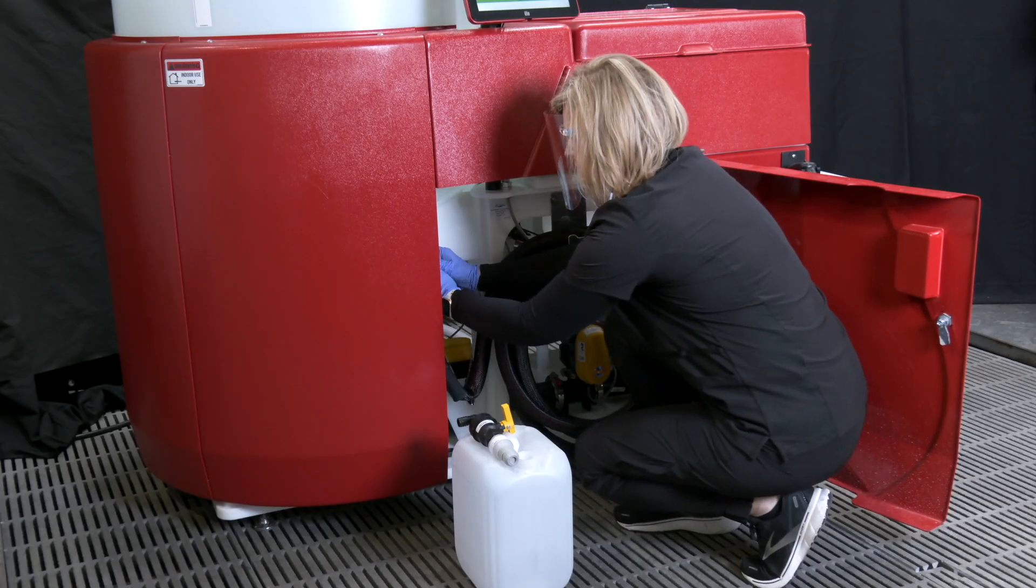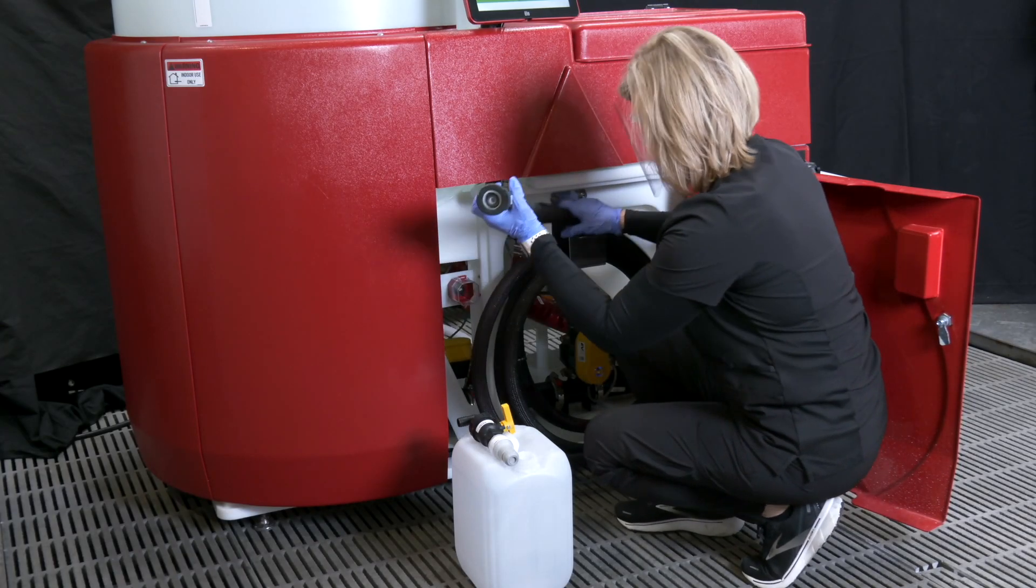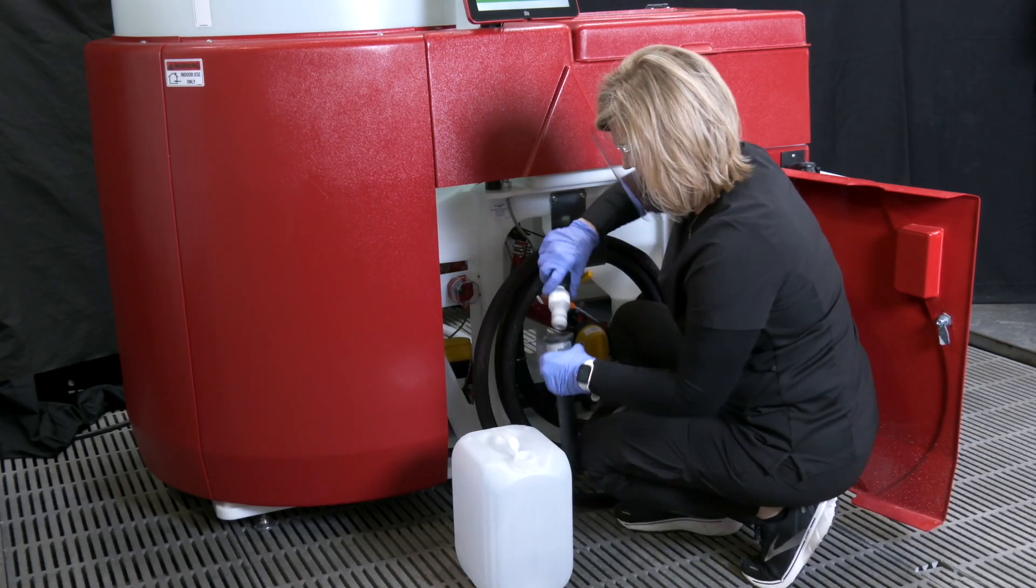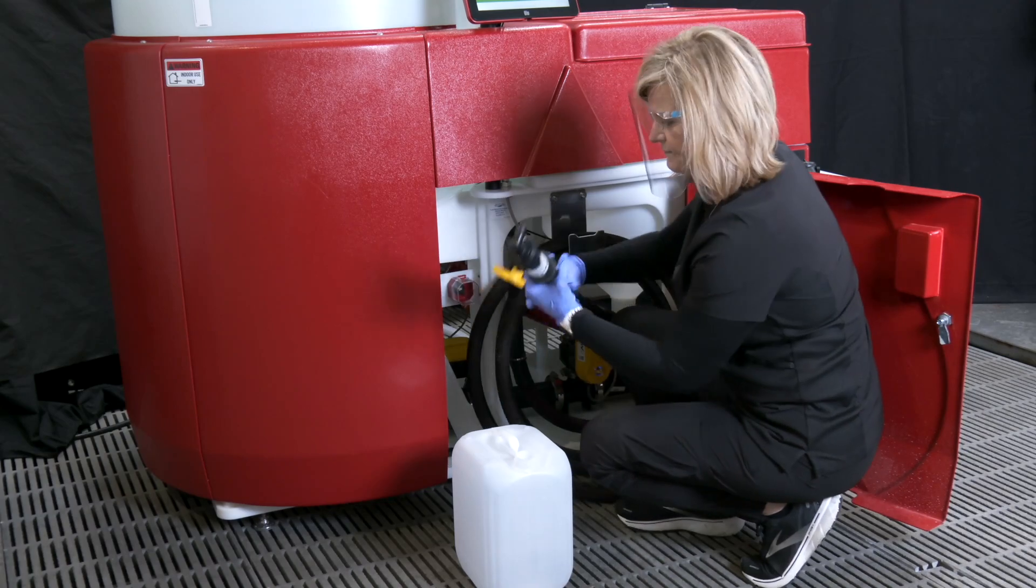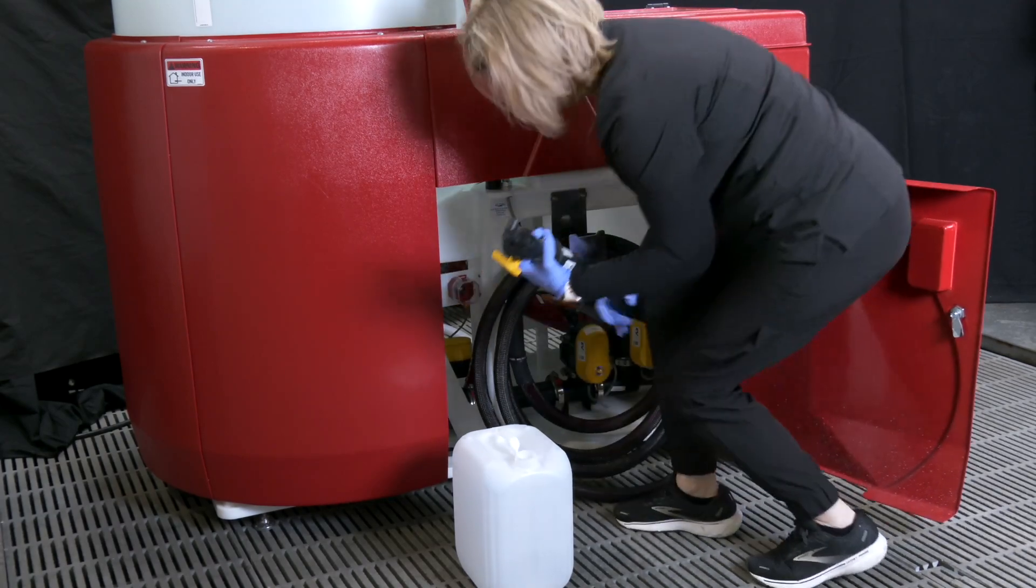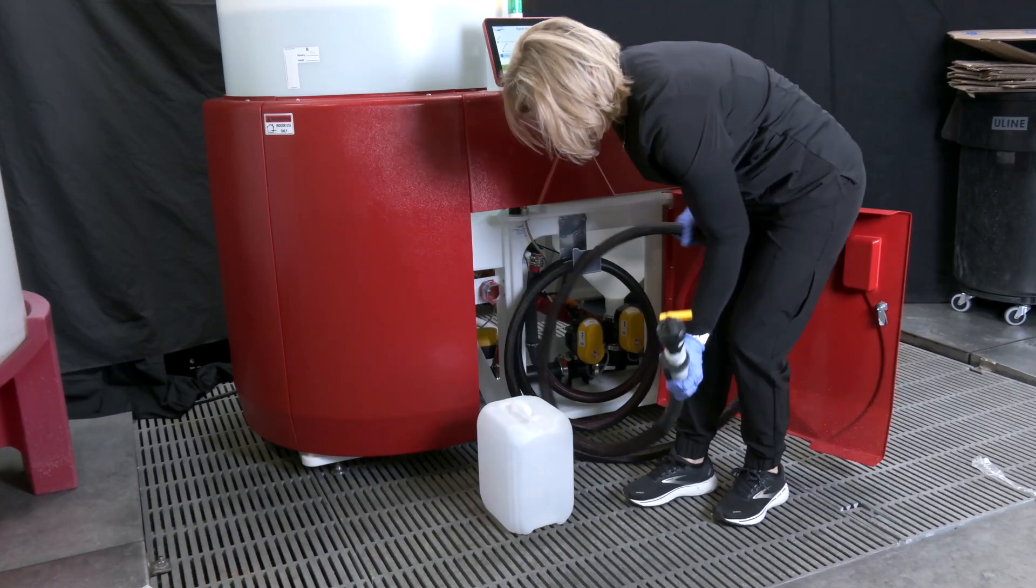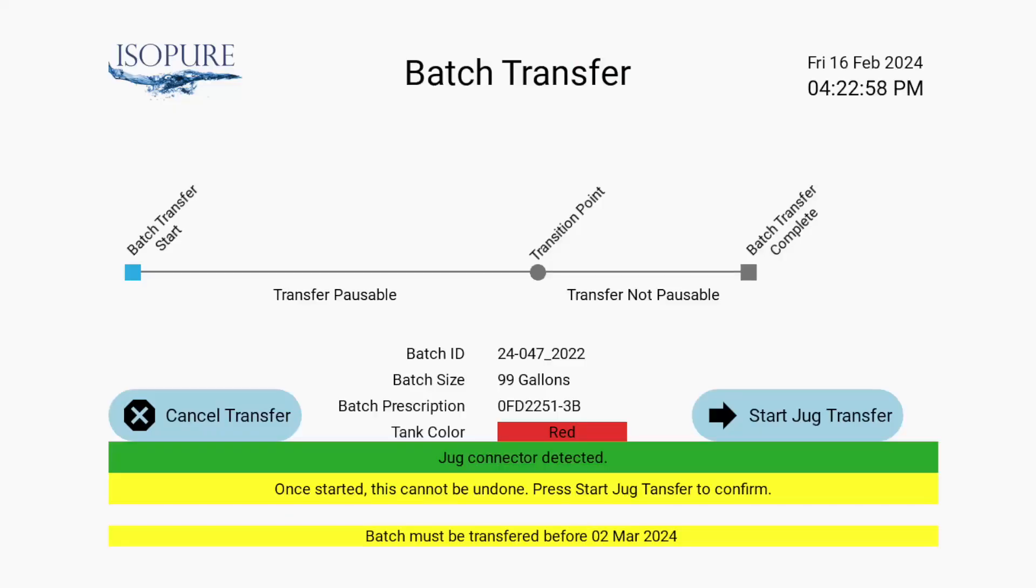Attach the transfer hose to the jug fill assembly and be sure that the jug you are about to fill is on a stable surface below the level of water in the tank. Acumix does not actively pump acid during a jug fill, relying instead on gravity to empty the tank.